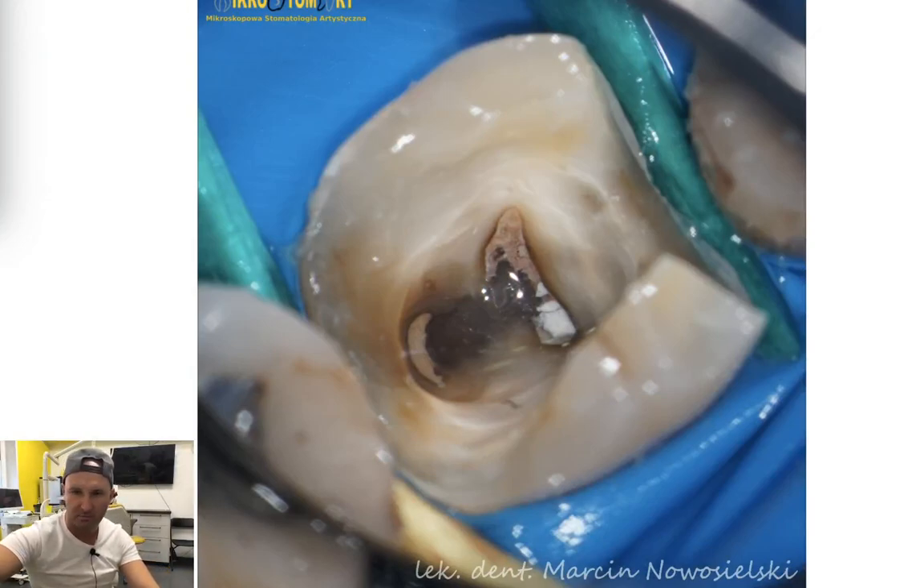We will also use block-out resin, and instead of a ring we will create something I call a block-out ring. I'll show you in a couple of minutes what to do with it, because when you try to place a ring here it won't hold — it falls off because you don't have a lingual wall, and the rubber dam clamp combined with no lingual wall causes the ring to fall. Trust me, I tried every ring I have and all of them fell off.